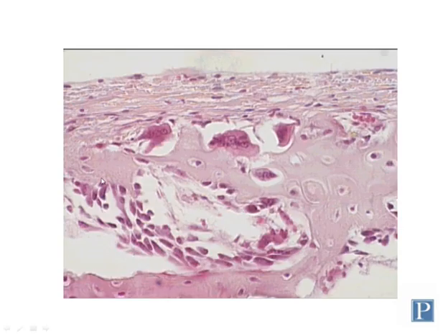Here's another section of trabecular bone. In this case, you have multiple deep Howship's lacunae. Here's one here. Here's another Howship's lacuna. Here's another one over here. And you can see multiple osteoclasts that are multinucleated sitting right here on these Howship's lacunae.